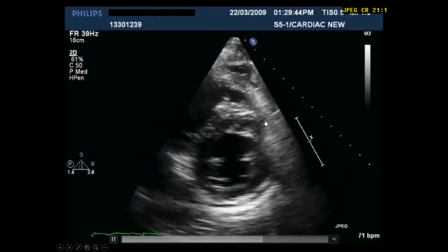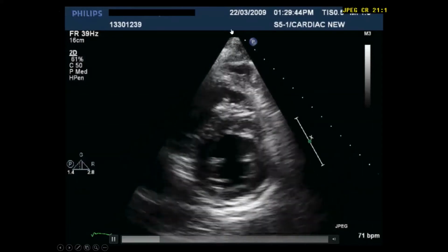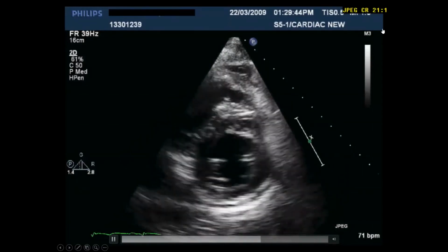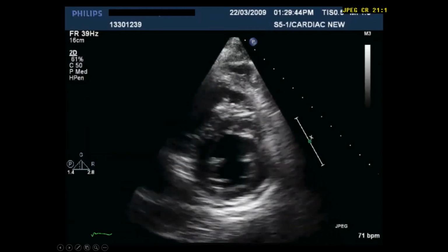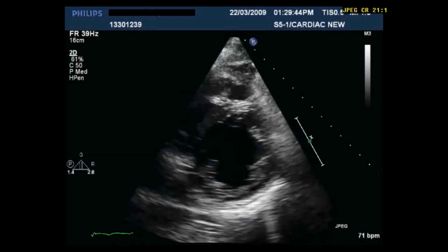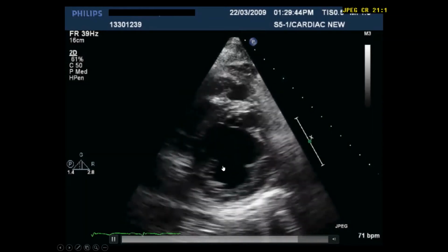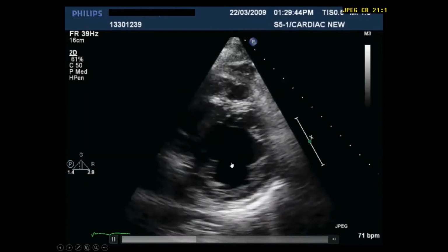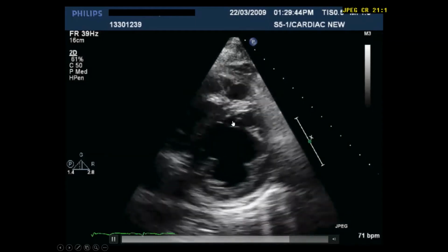You have to tell me that this is parasternal short axis LV view at the basal level. So this is an important part of your description. So parasternal short axis, LV short axis at the basal level, because we are still seeing what? Mitral valve, and we are still short of the papillary muscle. This is the mitral valve, so we are at the basal level.